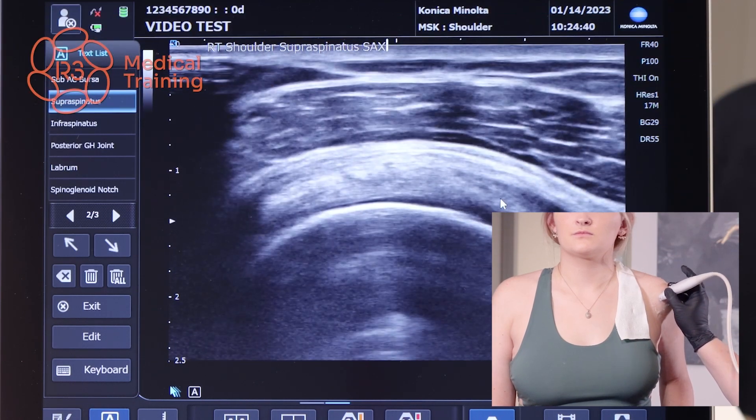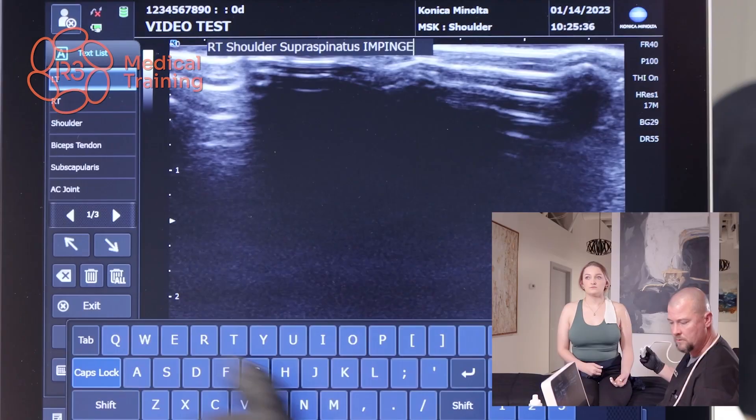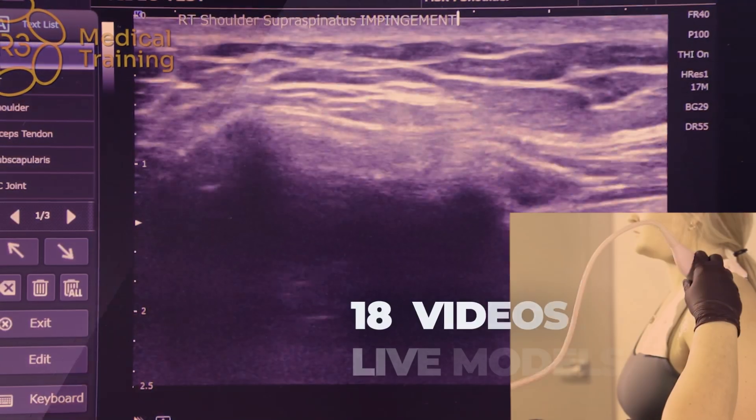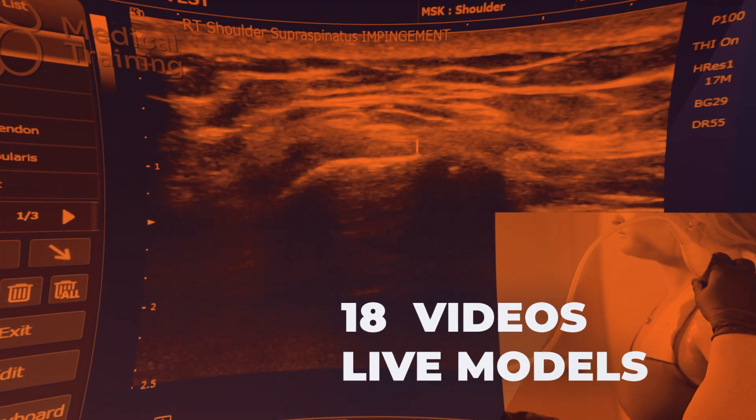The picture-in-picture format is super helpful for technique on probe placement and understanding the different anatomical views that result. There are 18 videos on live models where the scans are completely narrated by the sonographer.